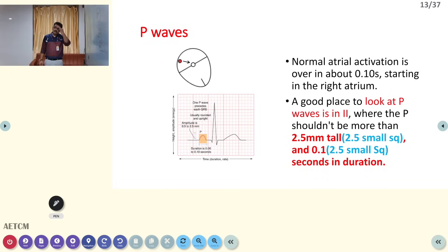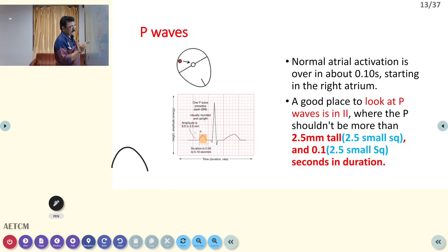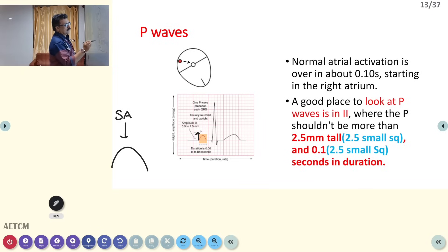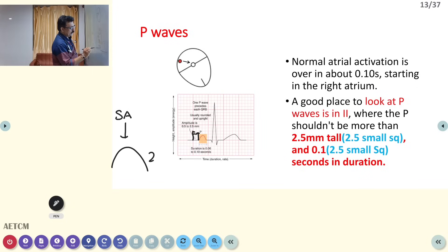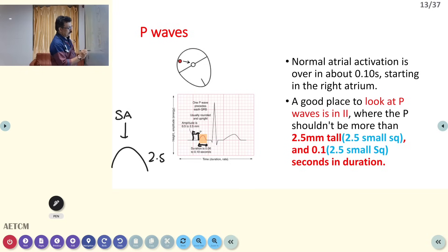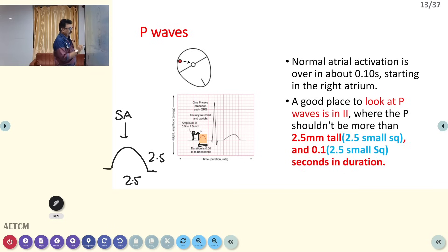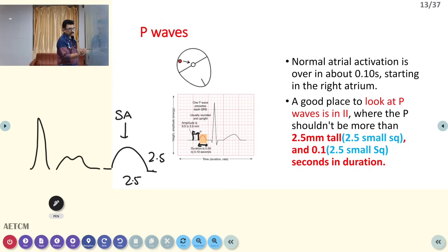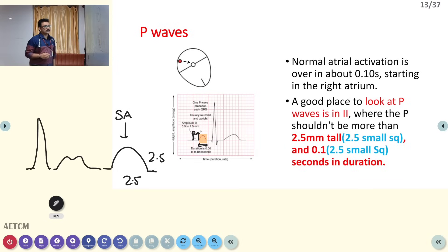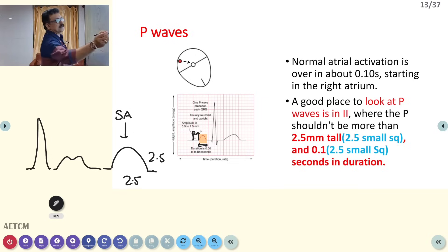P waves are normally dome-shaped, produced from SA node activation. The height should be up to 2.5 small squares and the width up to 2.5 small squares. If the height or width is more than 2.5 small squares, it is abnormal. P waves are best seen in lead 2.